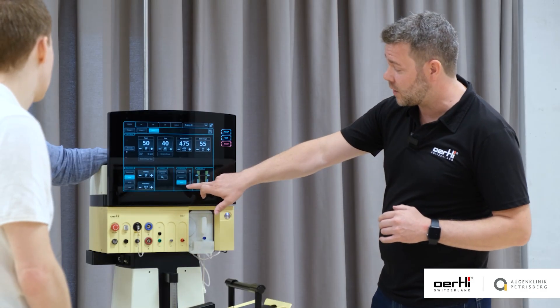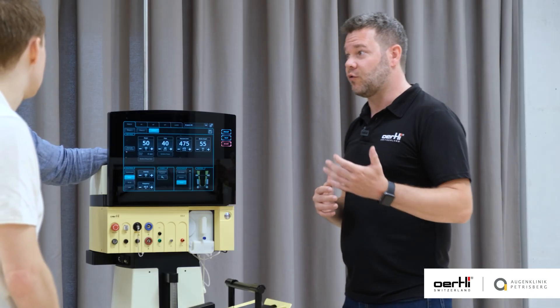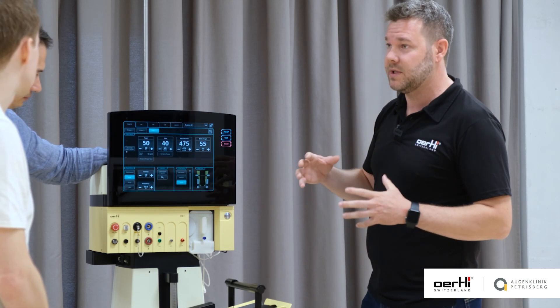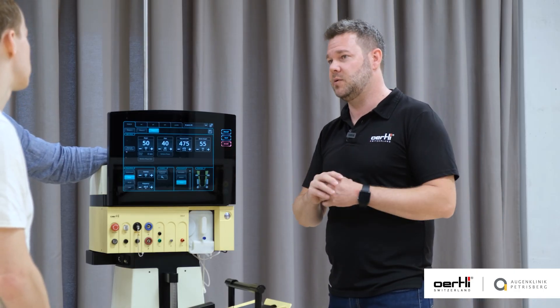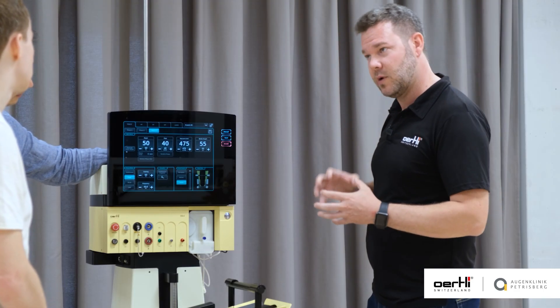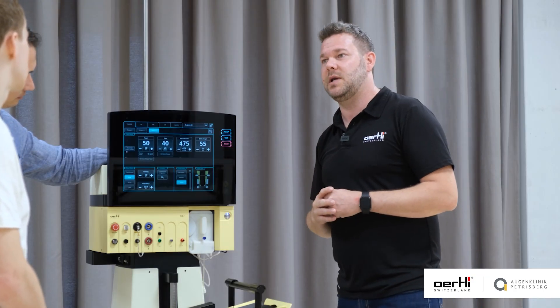Especially as I see you work with the speed bump, which gives you the opportunity to control the vacuum as soon as you have occlusion. You should definitely try working with higher vacuum settings — as soon as you have occlusion, see how you can increase the holdability, especially when doing direct chop, to have a tighter grip on your fragments.